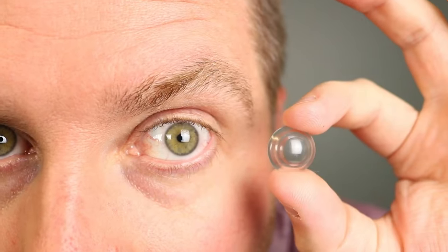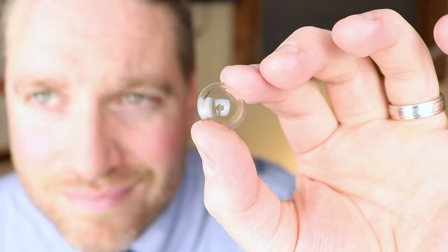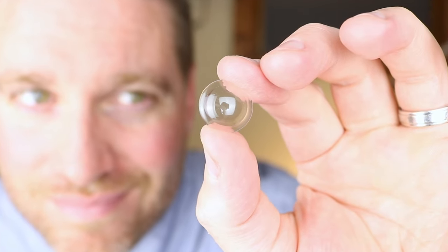Scleral contact lenses can be amazing contact lenses for some people. They can help achieve your best vision and will probably also be used for virtual reality contact lenses in the future. However, due to their size and the nature of the contact lenses, it can be pretty tricky to put in your eyes and take out.